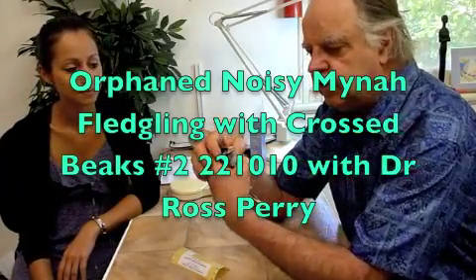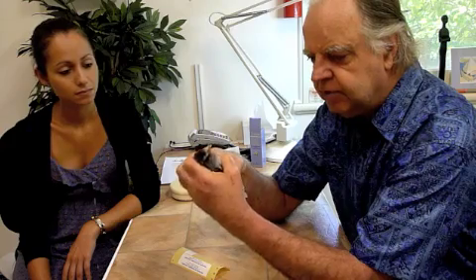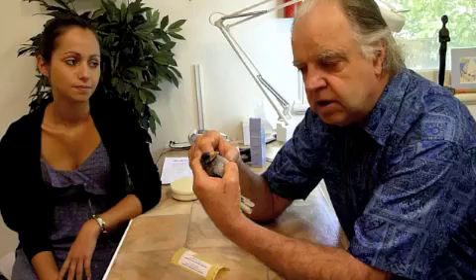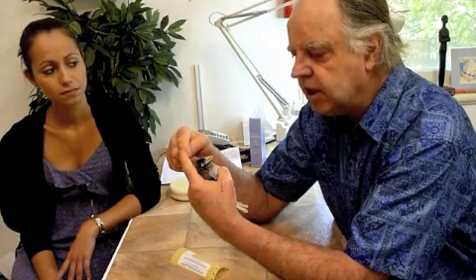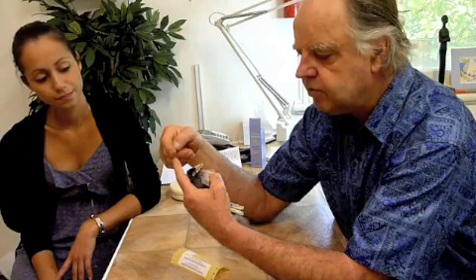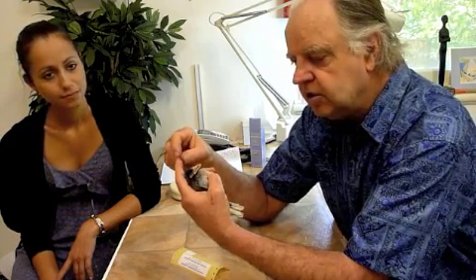We've had a great deal of difficulty trying to do anything for this little birdie. We've tried about four different procedures to get his beak in alignment and to keep it in alignment. First, I had to refracture the jaw because it was already a week over-ridden and calloused — fused together — and we had to get it repositioned to allow for lengthening of the jaw on the lower left side. We had to do that surgically.